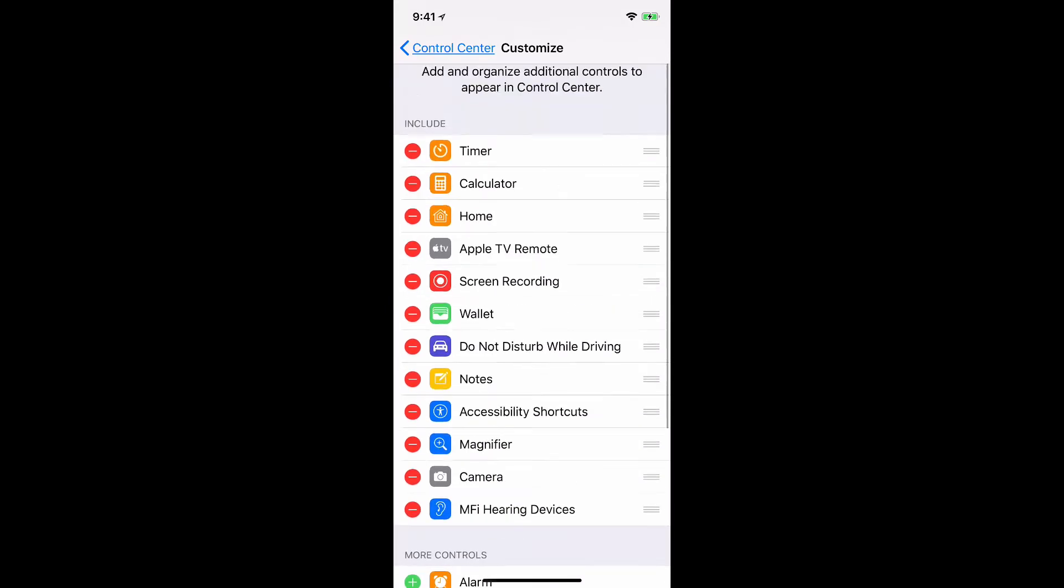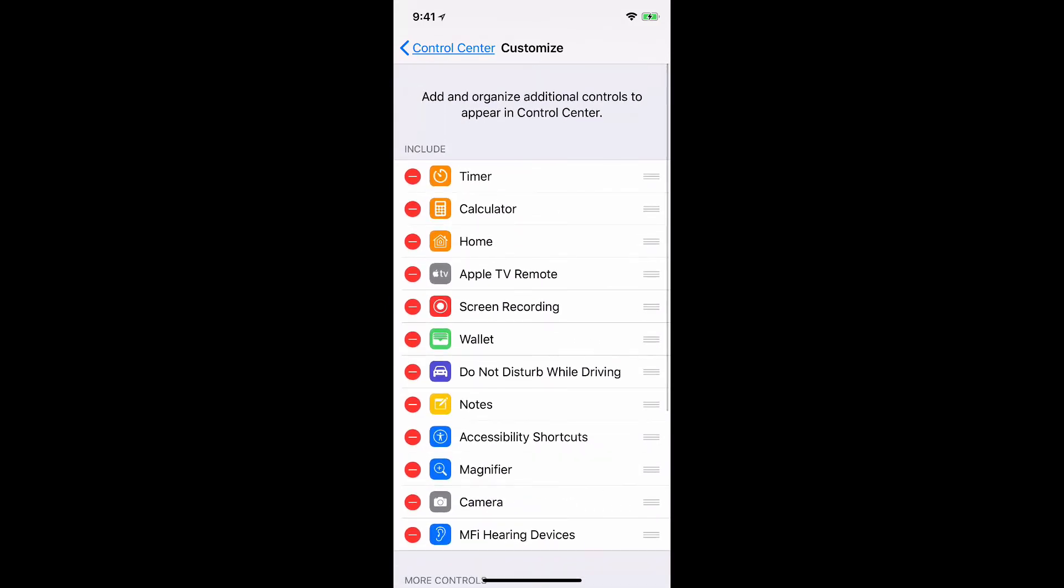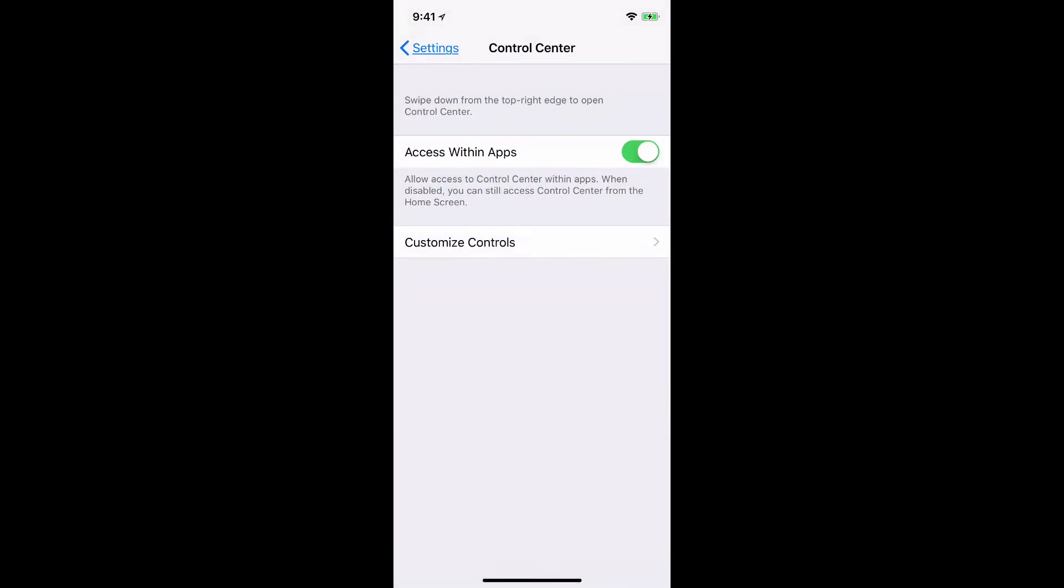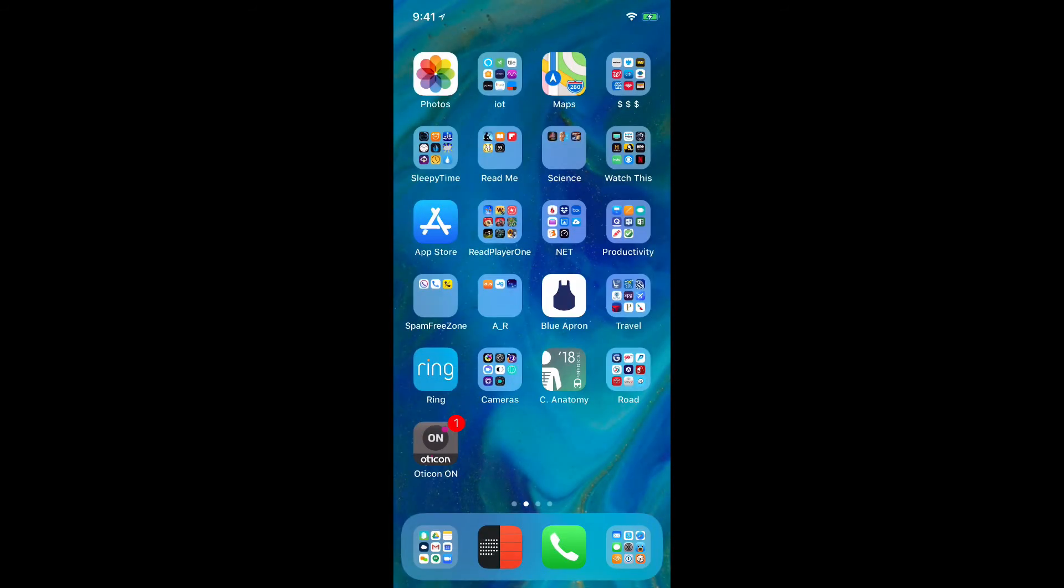As soon as I do that, it's now in my list of available items in control center and I'll simply come back out to the main screen.